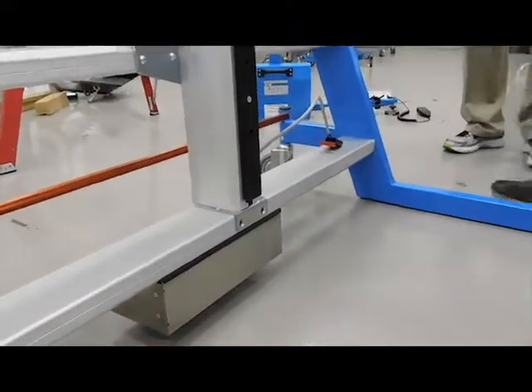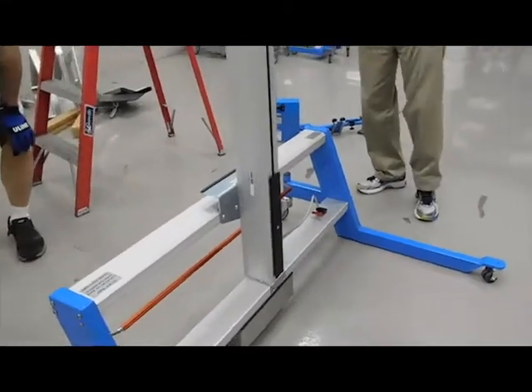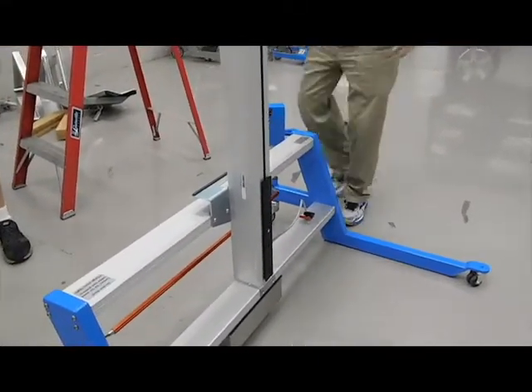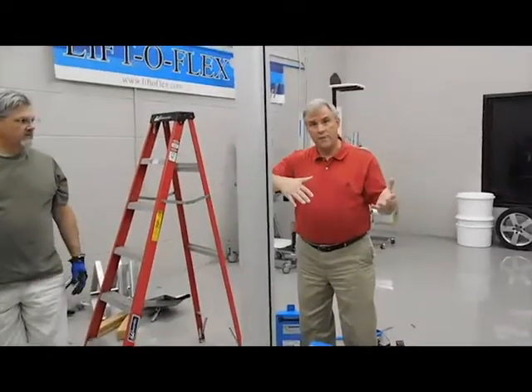Okay, so now the mast is completely loose from the base, and what we're going to do is pick the mast up off of the base and get it off of the lifter so that you can see how it's going to go back on again.